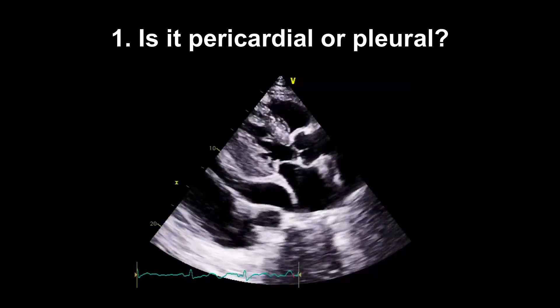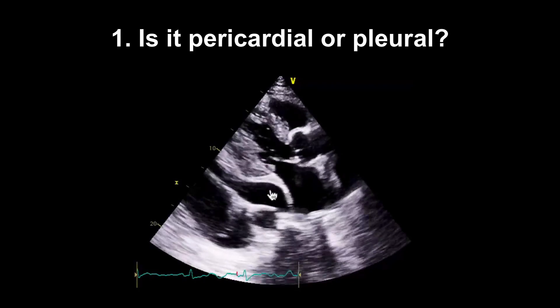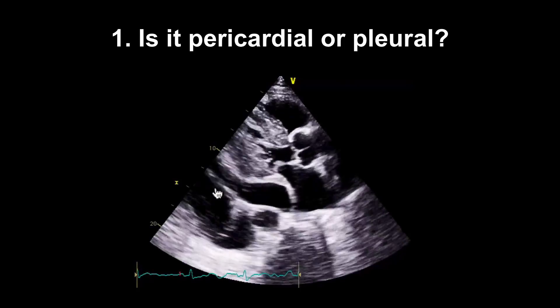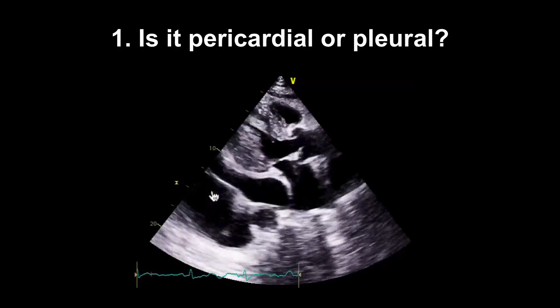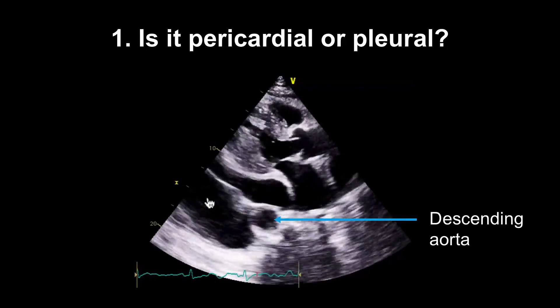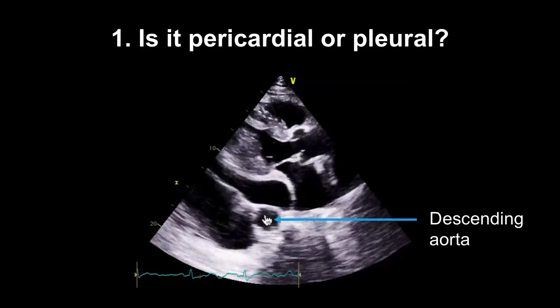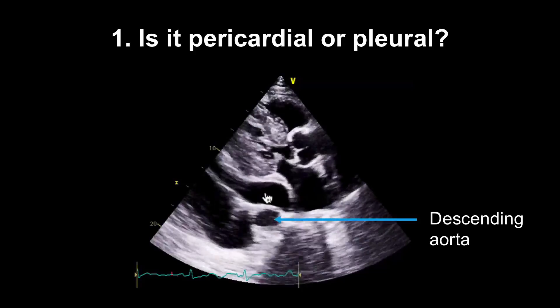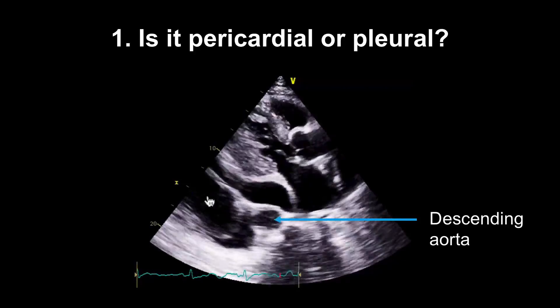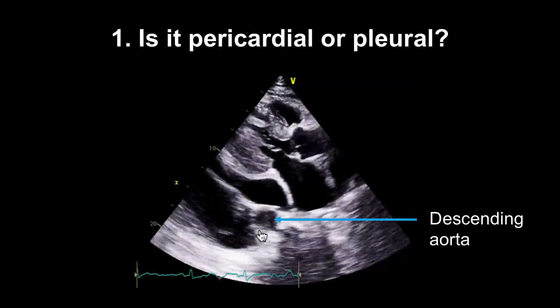The first question is: is it really pericardial and not pleural? This patient actually has both — a pericardial effusion here and a pleural effusion there. The way to distinguish between them is to check the position of the descending aorta. A pericardial effusion will be anterior to the descending aorta, and a pleural effusion will typically come behind it and may extend even further behind.